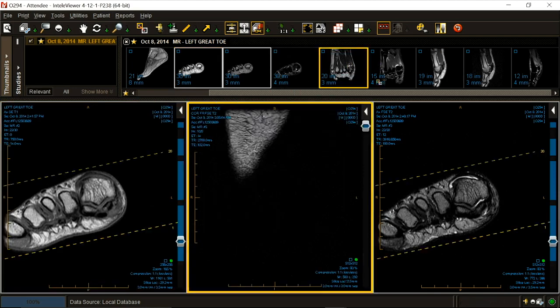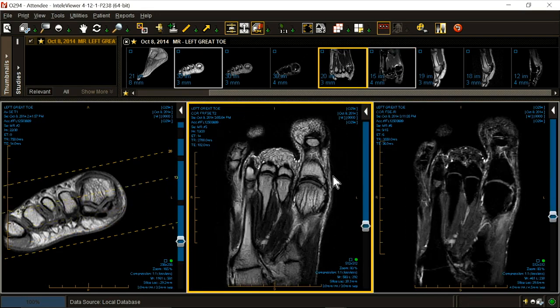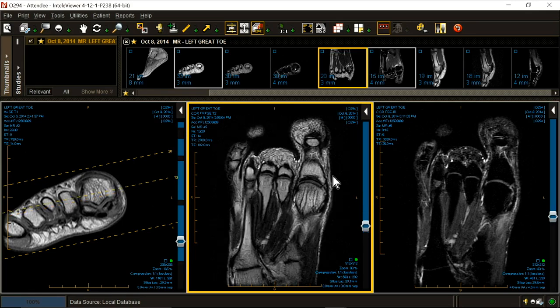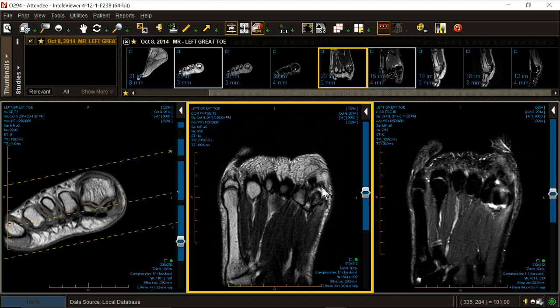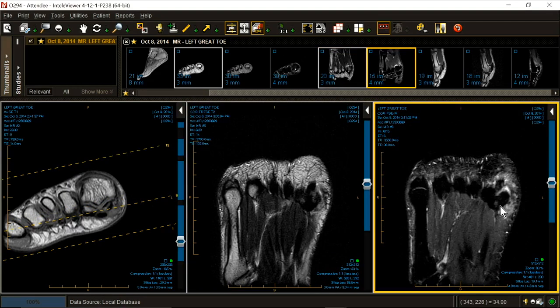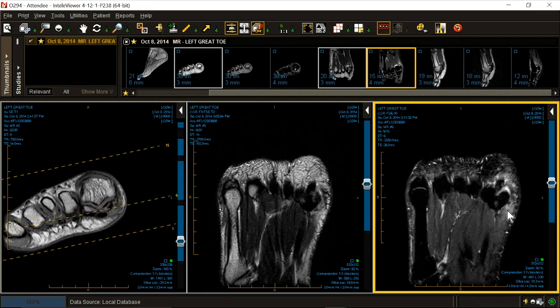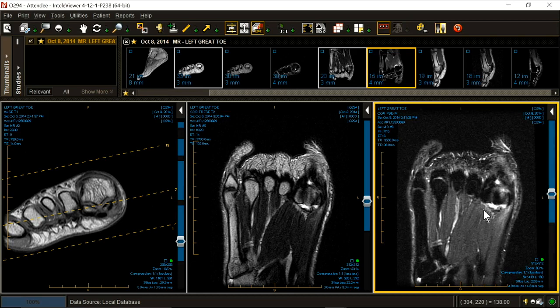Collaterals, part of our checklist. Didn't check those yet. Let's have a check. Remember our lady with the long second toe and the awful collaterals? These are normal collaterals. Now, I did say earlier that his flexor hallucis brevis attachment to the tibial sesamoid was intact. That's true, but it isn't normal. See how swollen it is right there? That is different than that.